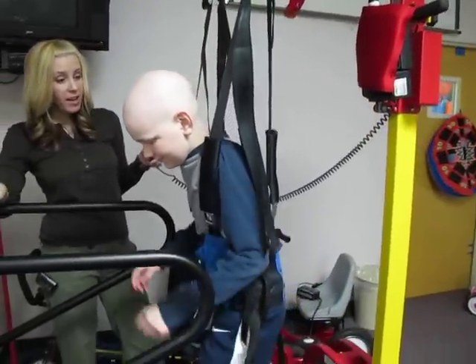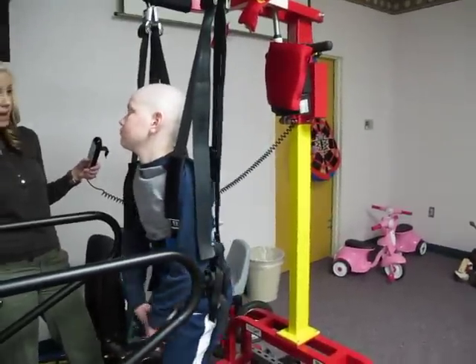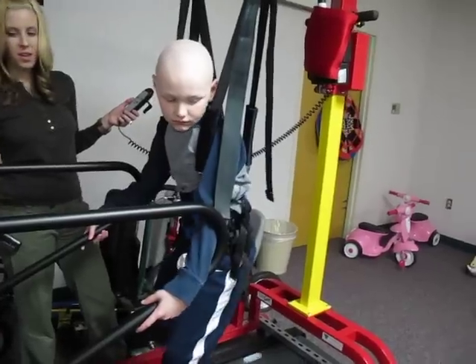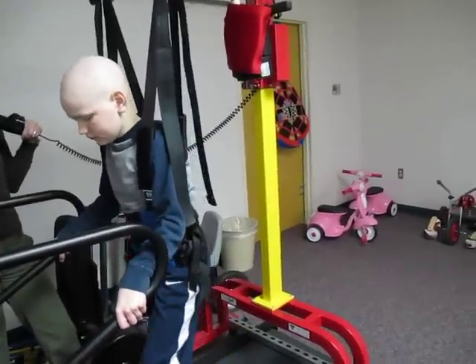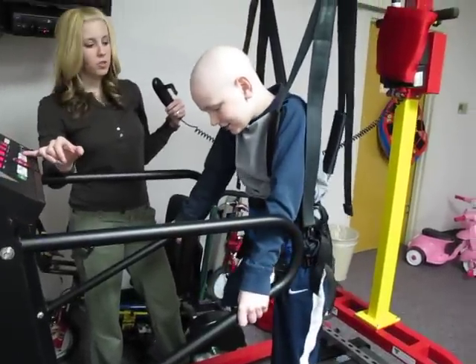Let's see what we can do with your leg on — I can make this go faster so you can practice walking faster, walking slow. You can practice running on this. That would be awesome. Because you'll get really good at walking with it, Truman, just on the ground. But then you're going to want to start trying to go a lot faster. So we can use this first so you can kind of feel what your body's supposed to do before you try it on your own.